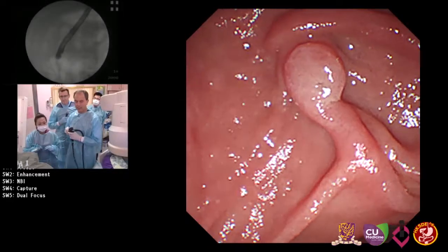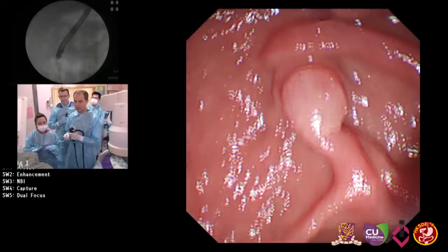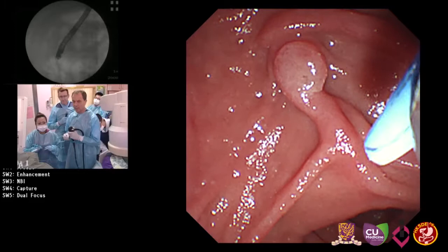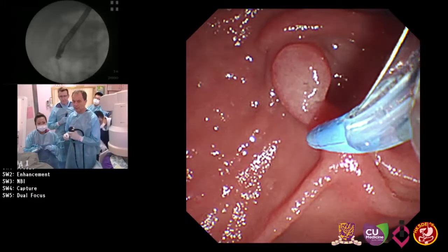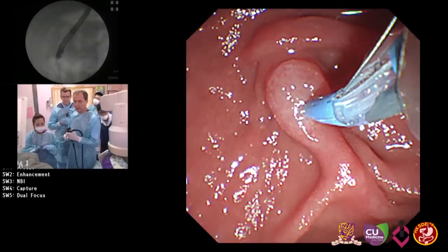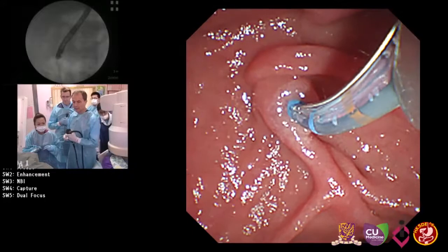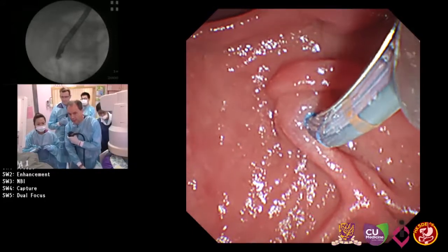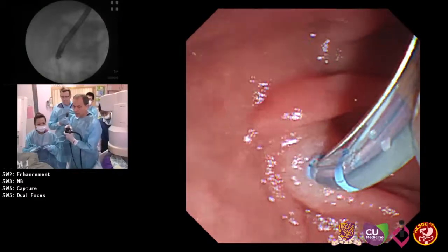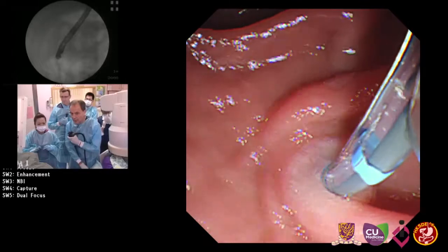So our plan is to cannulate the PD, and if we succeed, do balloon dilatation, and then we see if we have to fragment the stone, and we could try to do it intracorporeally with SpyGlass. Okay. So for cannulation, I'm using the sphincterotome. This is the autotome. And I direct the tip into a 2 o'clock position at a right angle. So I carefully try to insert it a little bit deeper, hopefully into the right direction. As you can see, I carefully maneuver the tip before we start trying cannulation or injection.